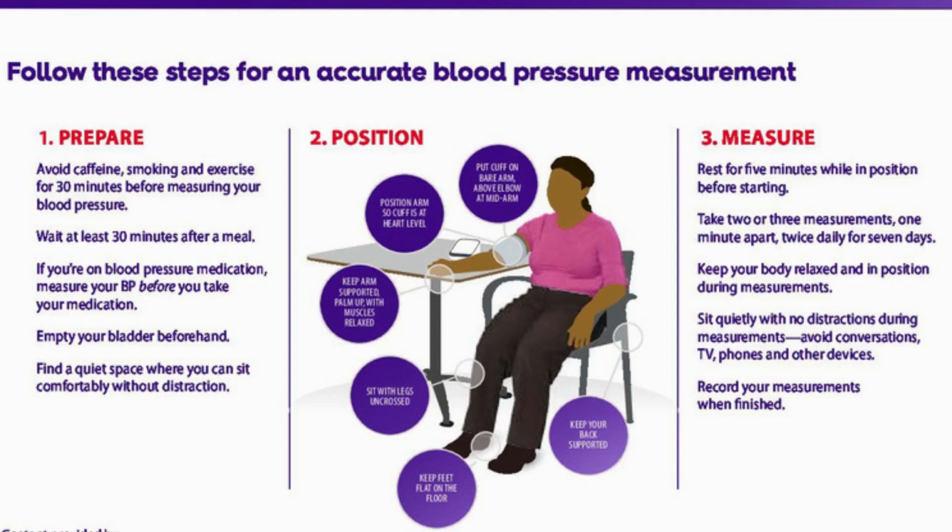We're going to show you how to measure your blood pressure using a sphygmomanometer. Measuring your blood pressure regularly is important for maintaining good health, and with the right tools, it's simple and easy to do. Let's get started.